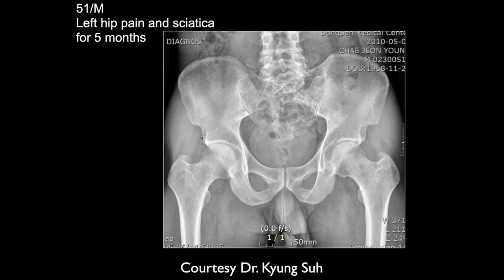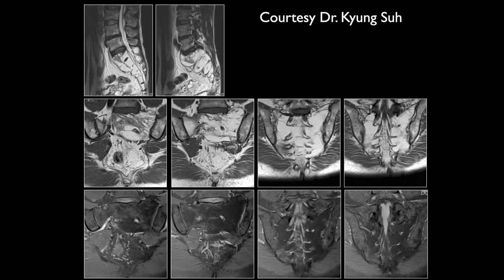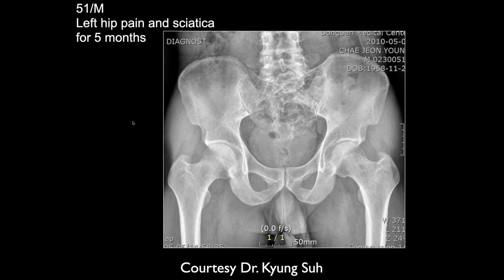I really don't see too much in the left femur itself, but now, on the T1 weighted images of the lumbosacral region, there's marked fat signal within the marrow of the sacrum. And as you can see, it fat saturates out. And now when I look back on this one, you can see it's pretty lucent compared to the rest of the bones.